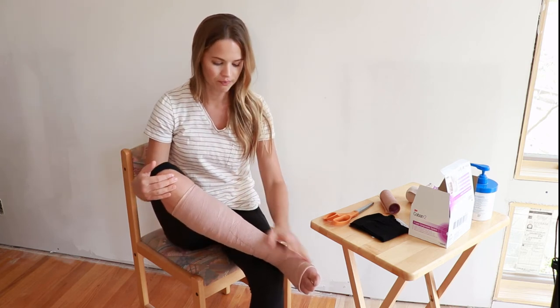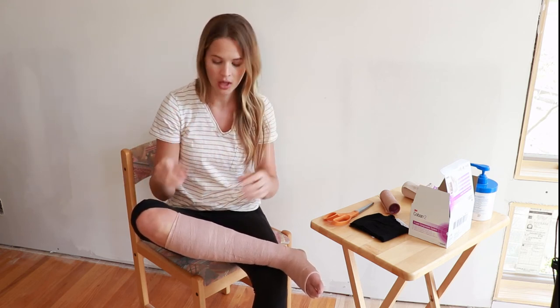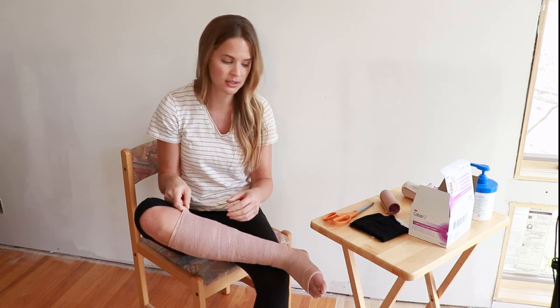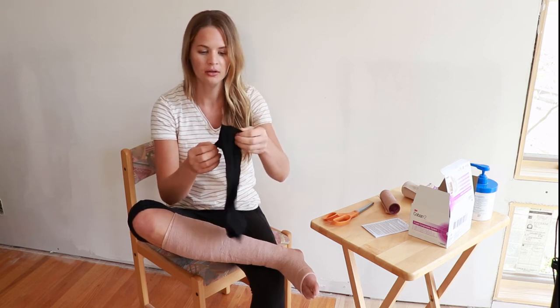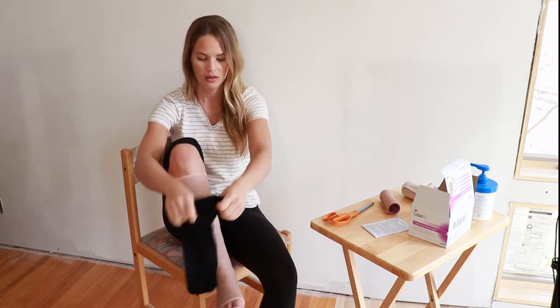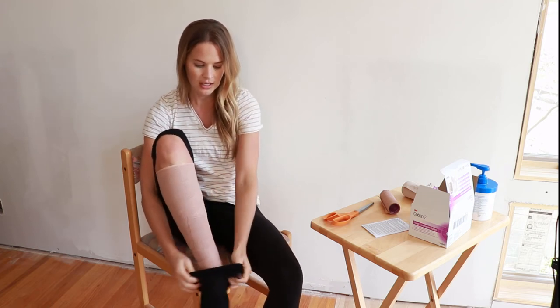And that's it. It's like a cast so it's not going to roll down like your short stretch will. As you start to shrink and the volume of your leg or arm goes down, this is going to get a lot more loose — and that's okay, it still shouldn't fall down. On top of that you can use your liner stocking, just like a stocking you put over the top so you don't stick to everything.